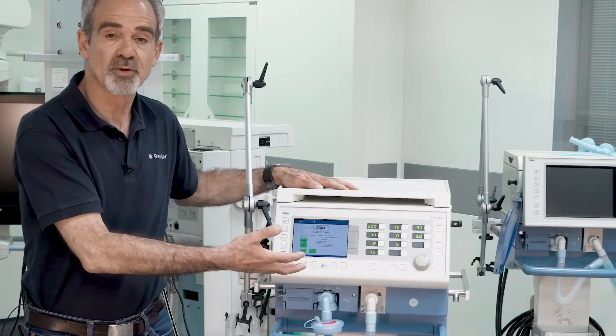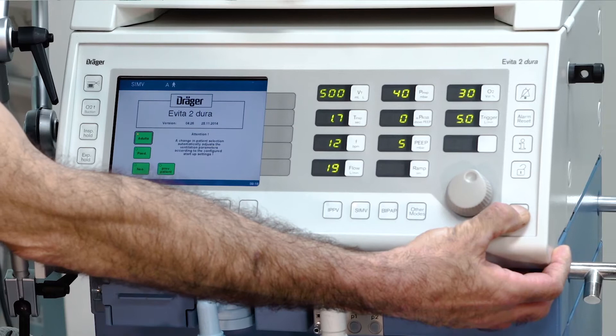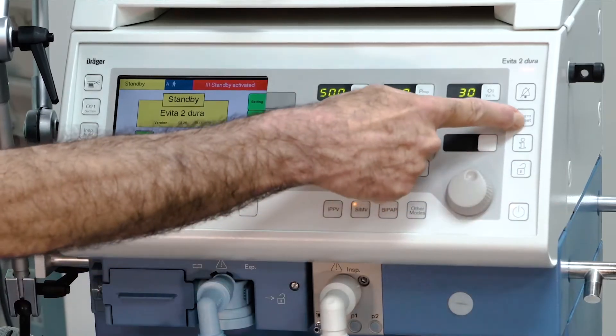After the boot process, put the device into standby by pressing the button on the right corner and confirm standby by pressing alarm reset.